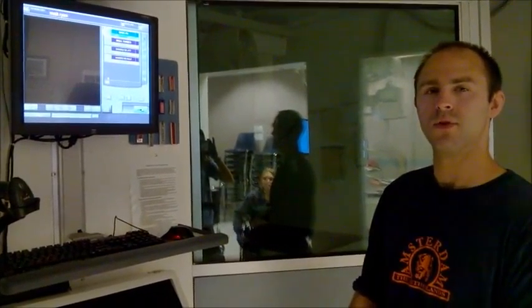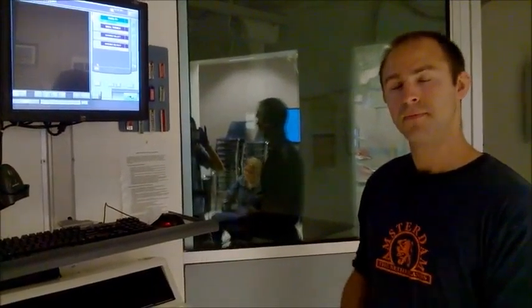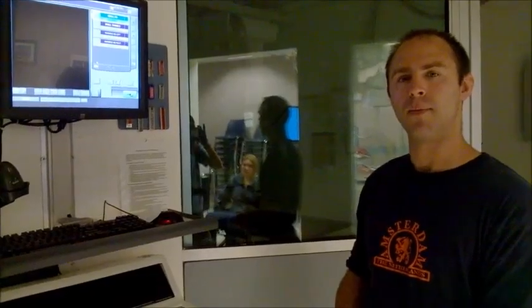And I cleaned the vertical grid, and I'm all ready to go. And I have my IR 8x10. So I just have to get my patient now.